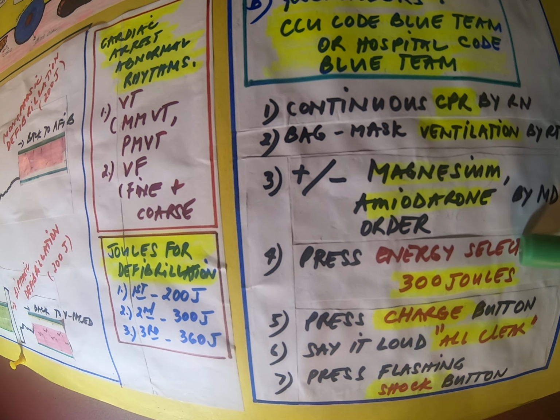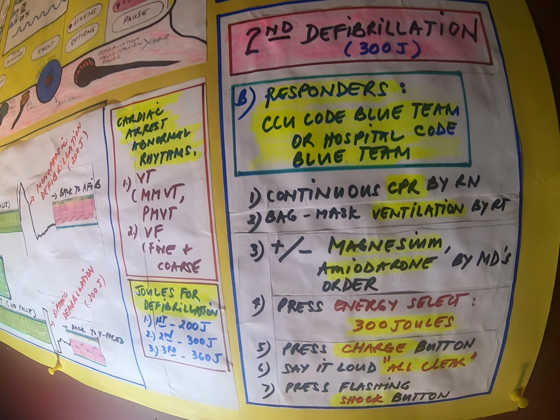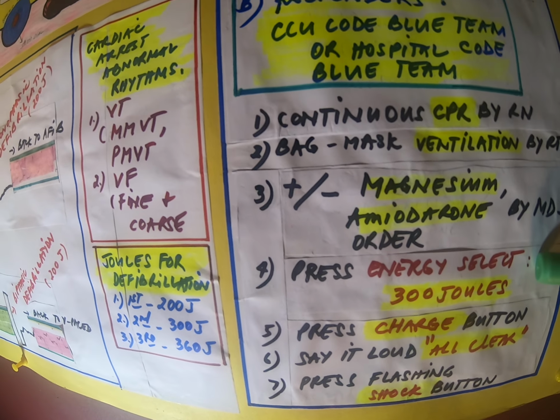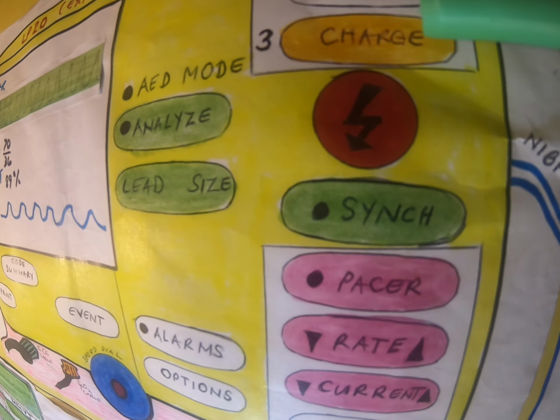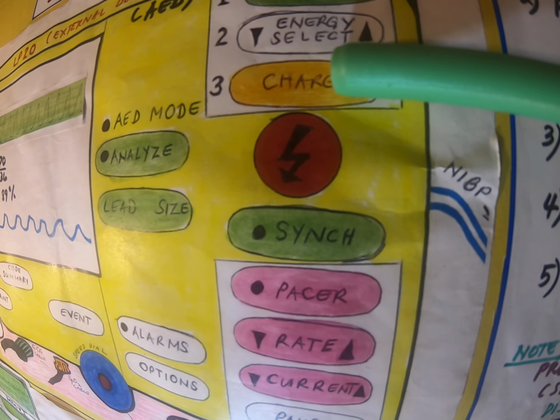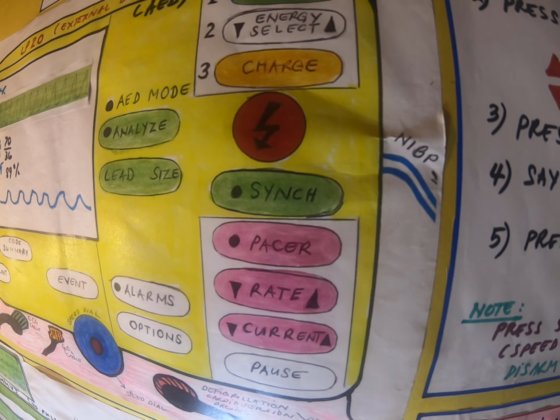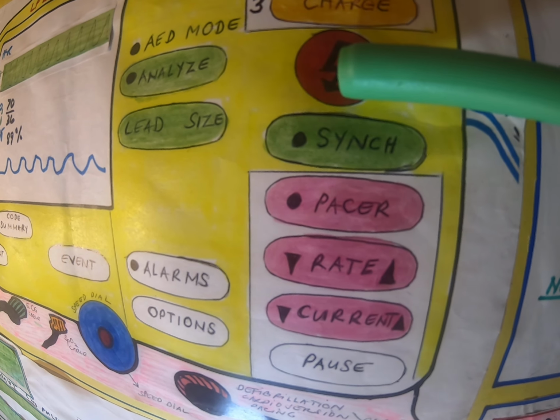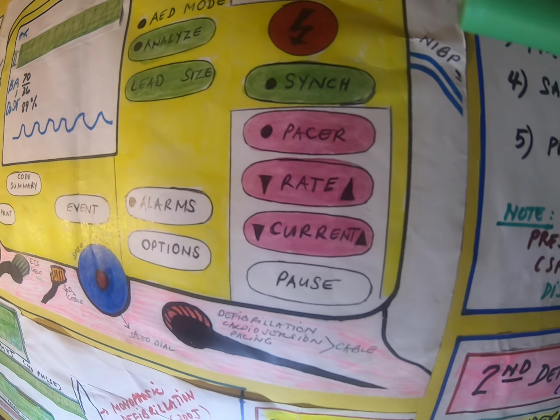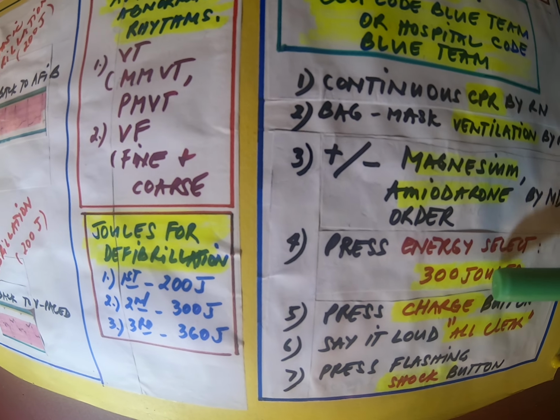The defibrillator RN will get ready with her second defibrillation attempt, and the CPR will be in 2 minutes. While waiting to shock the patient, she could have that 300 joules ready and already have the charge done. If the nurse is finished with her CPR after 2 minutes, all she has to do is press the shock button.